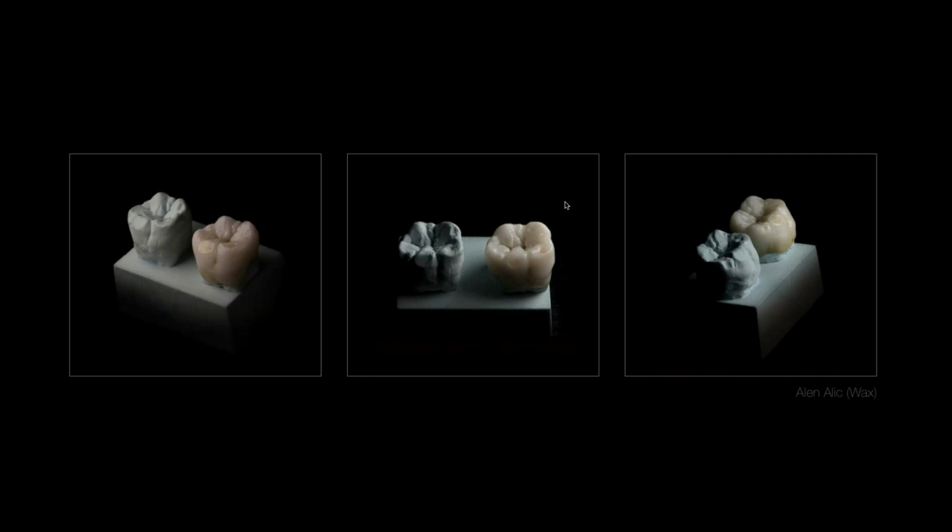First we copy it with one color wax, with gray wax, but after that we start to copy the same tooth with color, to add not just the shape of the tooth but also the color of the tooth inside.